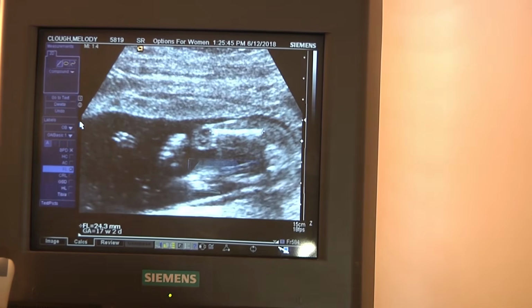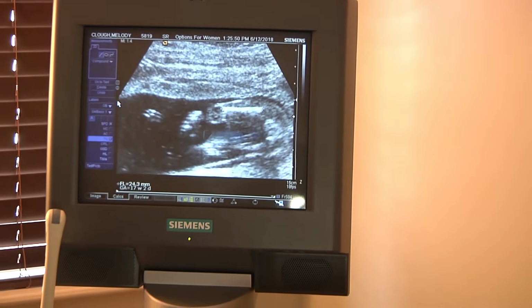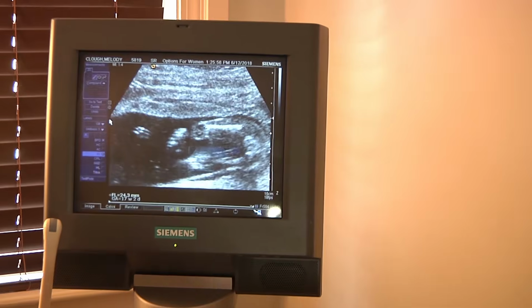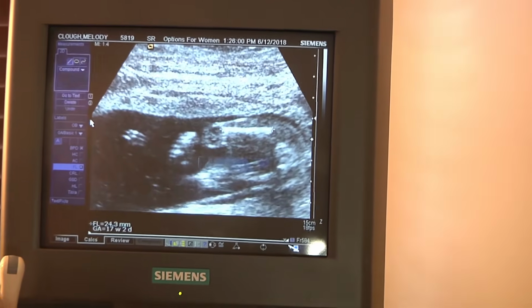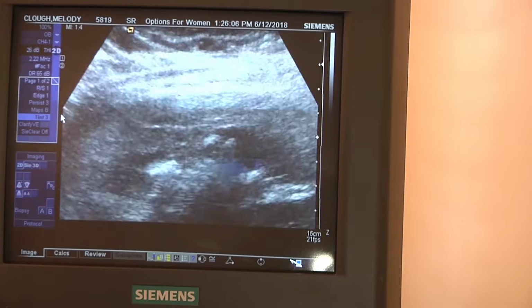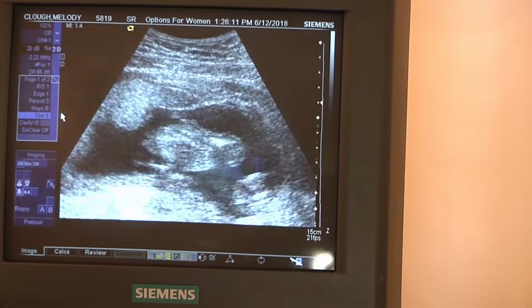So our next one's here. I'm just going to take a quick look and see if I can see the sex, okay? Thank you. Very good. All right. This is not a revealing party, by the way. All right, freeze. Okay. And I'm going to take it off of zoom.